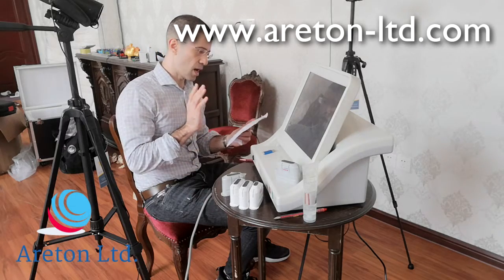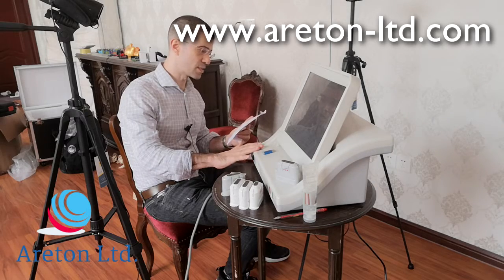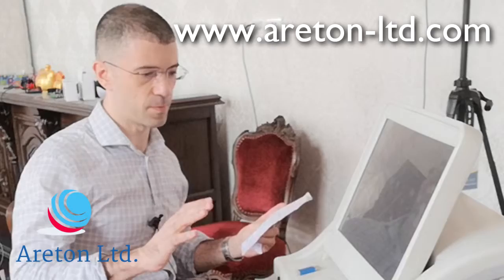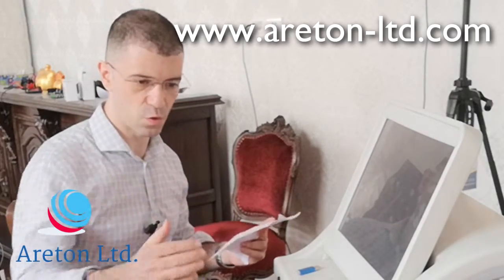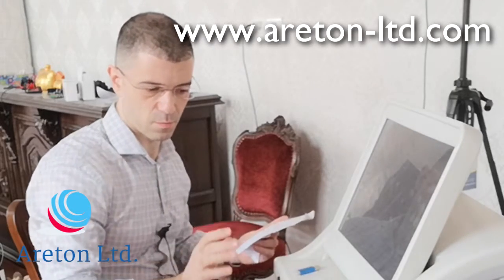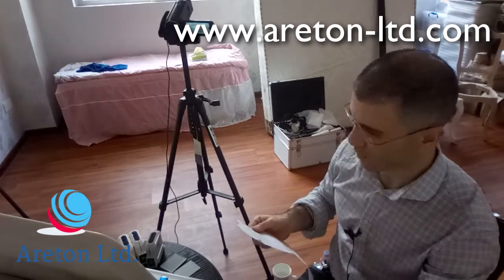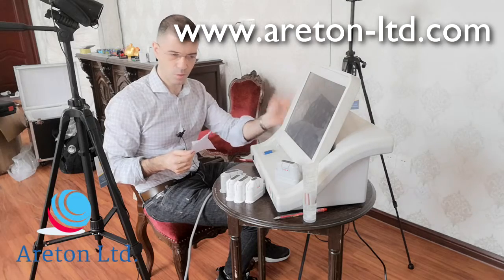We're going to talk about how to insert the cord first of all — it's quite easy to actually put it together, but we're going to go over a few things in terms of how to assemble it. It's extremely easy to put the cord at the back, so we're not going to go into detail on that. There is also a switch at the back of the device.